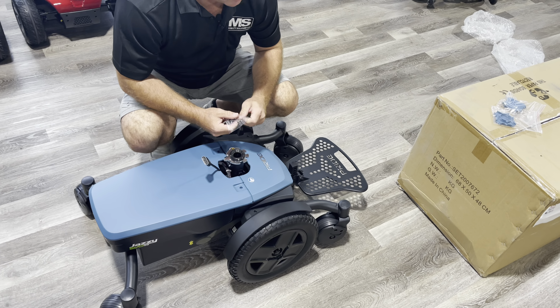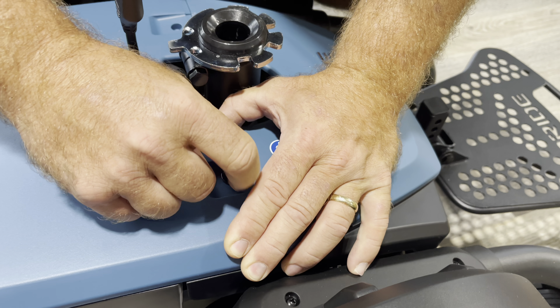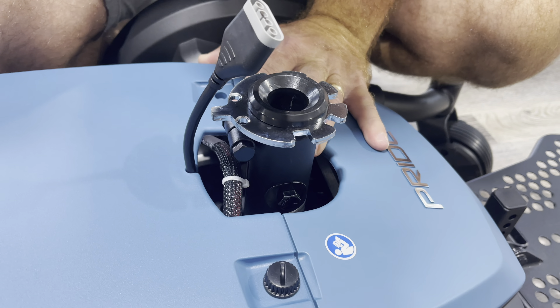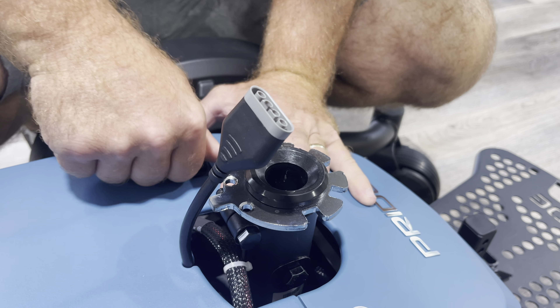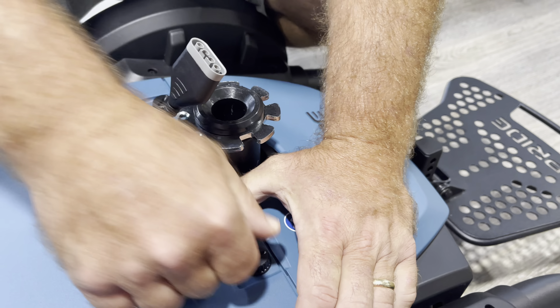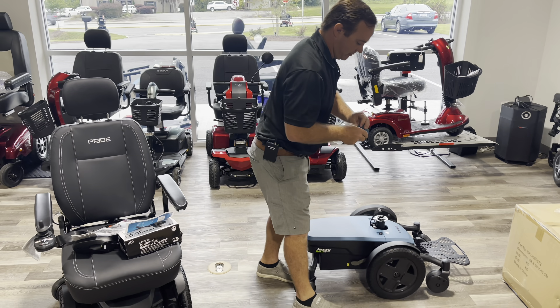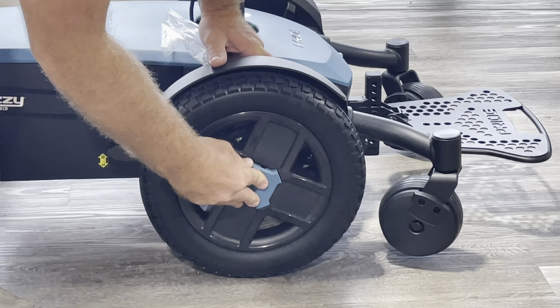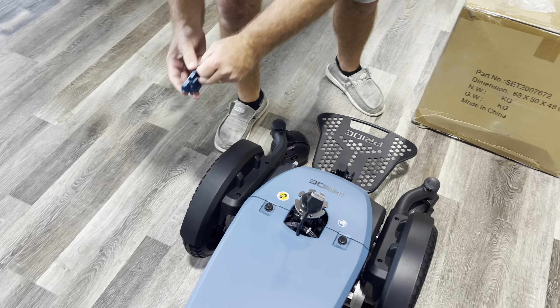This is really pretty. There are two different shades of blue. You're going to want to push this a little bit - that's what you have to do with these - and you can tighten them down with your fingers. If you want to tighten them down a little bit more, you can use a little flathead screwdriver. These just clip right on, so you'll see the design - you're just going to pop it right in and do the same thing on the other side. Just pop it right in. That's all done.